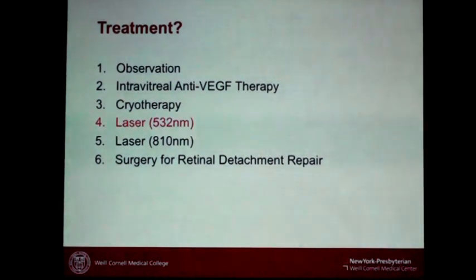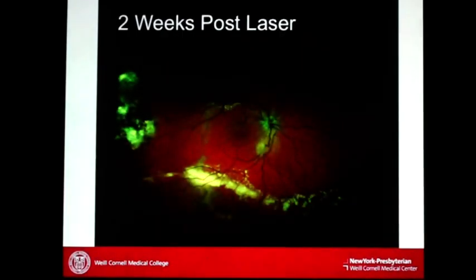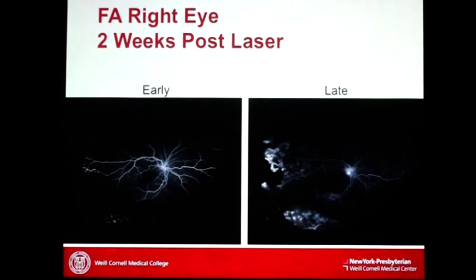So this is not really on imaging, but just a note, Coats disease, I usually laser with a 532 nanometer laser. So it's green, right? Because what's your target? It's red, right? So the red gets soaked up by green better. Okay, here's post laser. Okay, great. This isn't going to go away, the detachment. But what do I always do? I always follow up with the fluorescein.